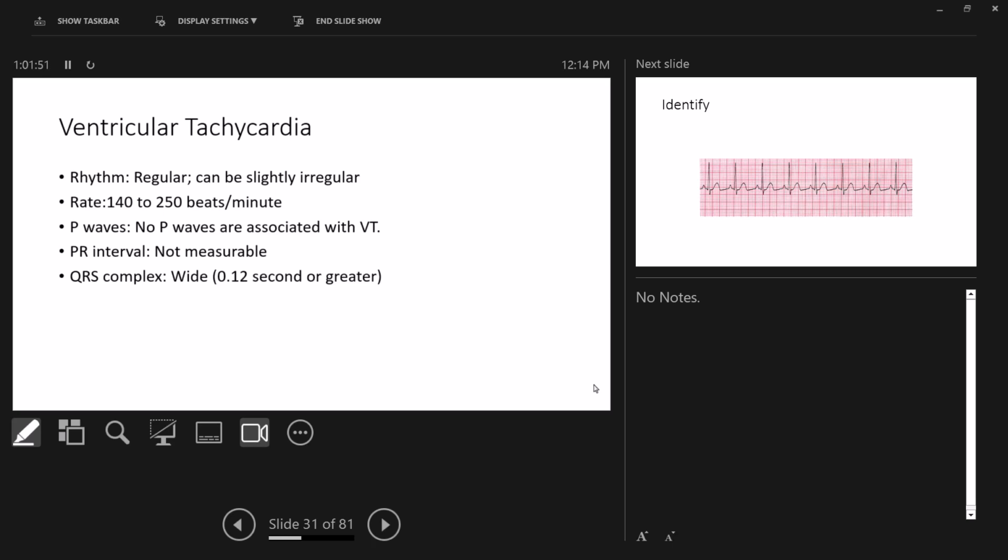With torsades, we do have a pattern that repeats itself. With VFib, you're not going to see that. This is not a really good representation of VFib because you could say, well, that's just really fine torsades. But the size of the complexes that you're seeing there is what makes the difference, and there is no pattern whatsoever. Okay? Anybody else?